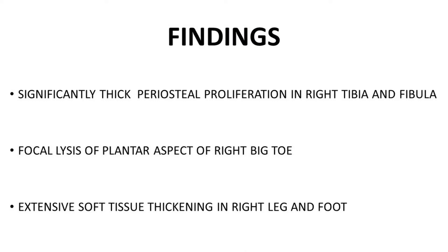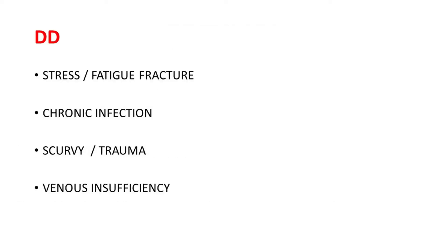With these findings, what are the differential diagnoses we can consider? The first and most common is stress fracture or fatigue fracture. The second is infection — a chronic infection like chronic osteomyelitis. The third is subperiosteal hemorrhage due to scurvy or trauma. The fourth is tumor, and the fifth is deep venous stasis — long-standing venous stasis.